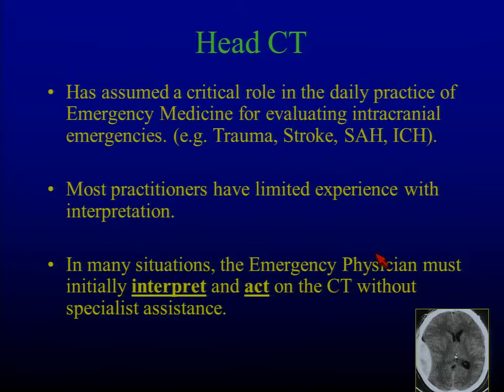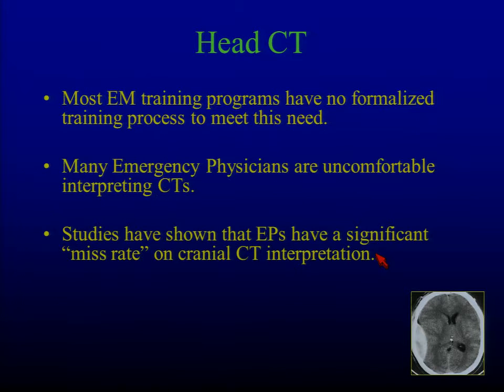What I found when I was first putting together a way to teach head CT was that most physicians, particularly at that time, had very little experience with interpretation, but still many, if you look at curricula for residency programs, an awful lot of them don't have any formal curricula for learning how to read a head CT. And I think there's lots and lots of things you need neuroradiologists for, and they're great, but there's lots of things that I think I need to know how to interpret and act on at 2 in the morning without waiting for someone to tell me what's going on.